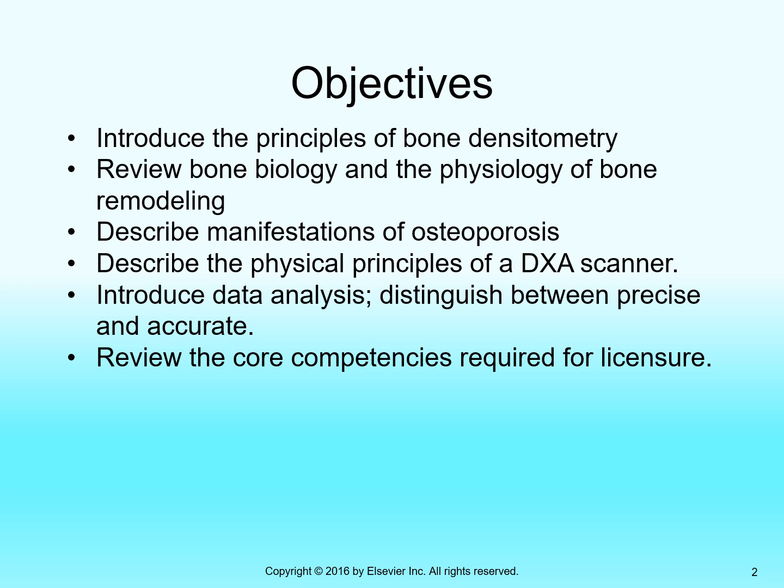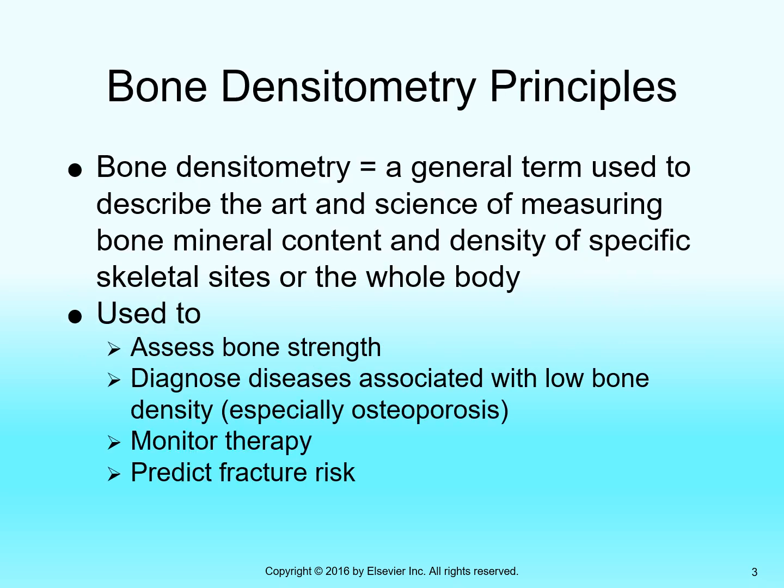There are some requirements for it, and I'll lay out those requirements through the course of this lecture. So, bone densitometry. I just reset because I forgot a definition, but I remember the definition. So here we go. Bone densitometry is measuring bone mineral content.